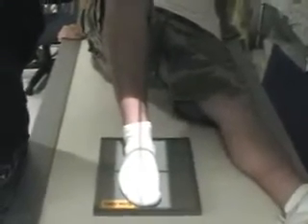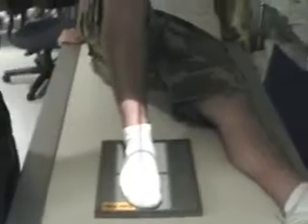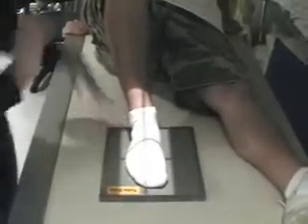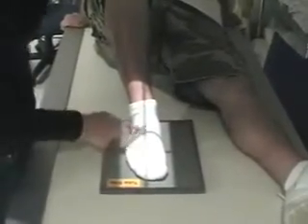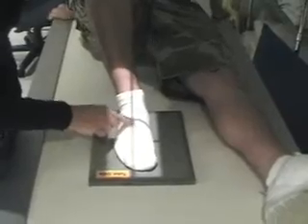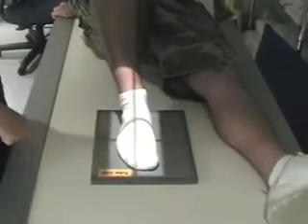Last time I checked, I wasn't. I took a pregnancy test this morning. Yeah? Came negative. Good to know. Base of the third metatarsal. Is that it? I would say that. One, two, three. Right there. No, it's got to be further up. Oh, it is there. Okay.